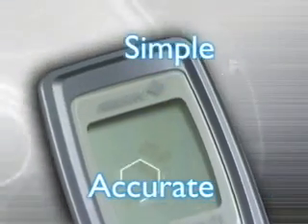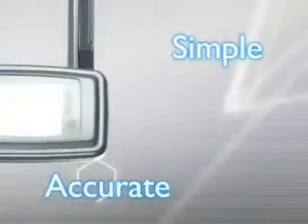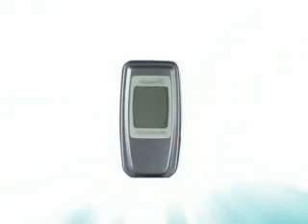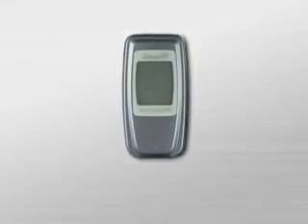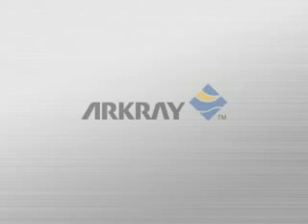Simple, accurate measurement of blood glucose. Superior functionality in a remarkably slim and compact design. For a healthier, more stylish lifestyle. Glucocard 01, from ARKRAY.